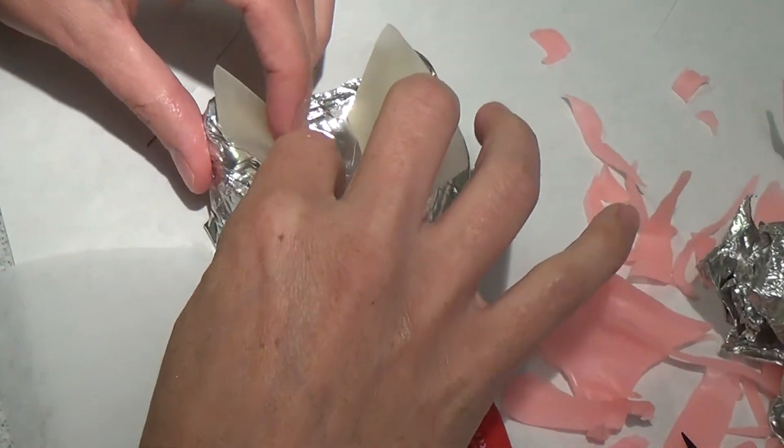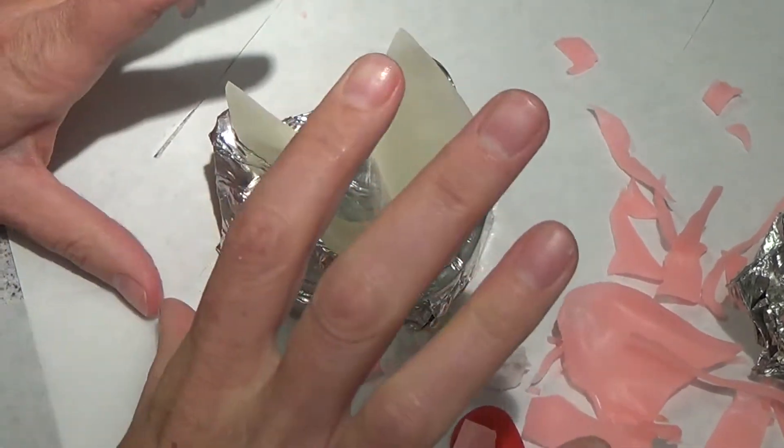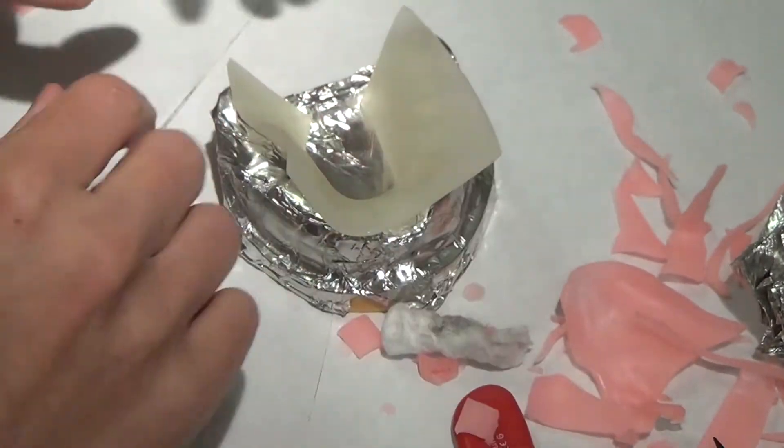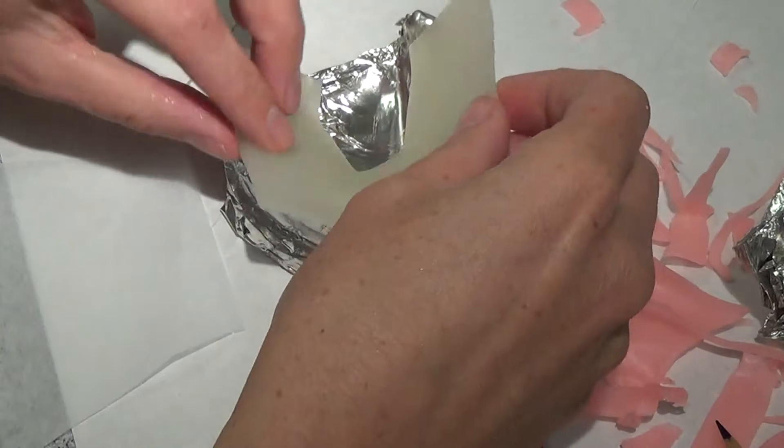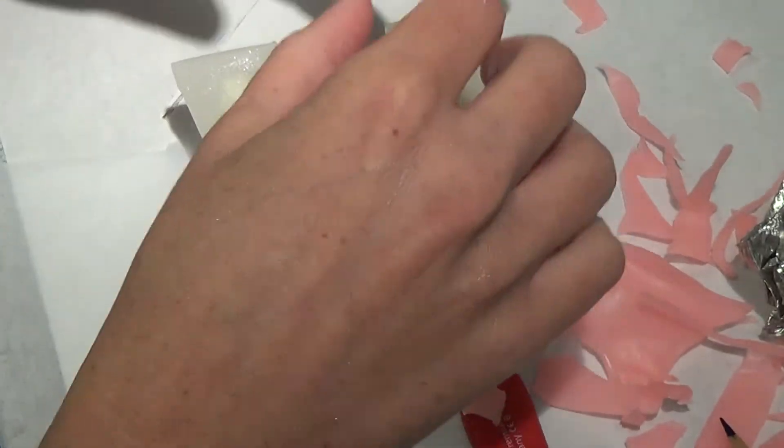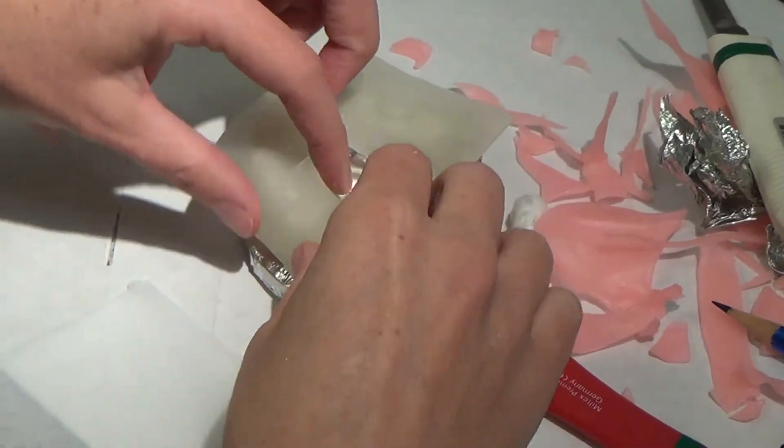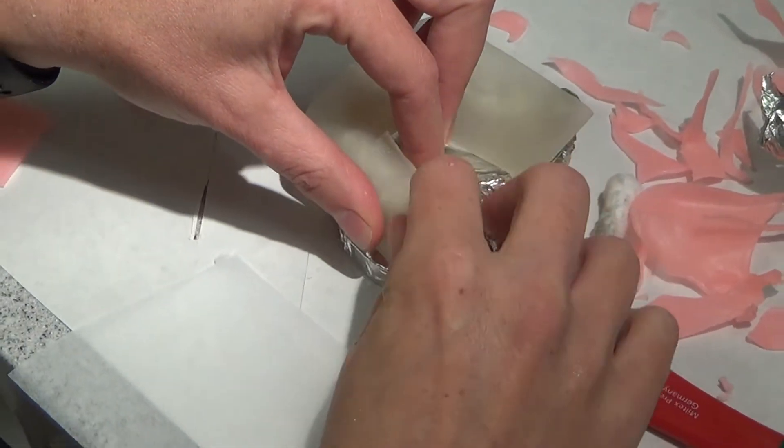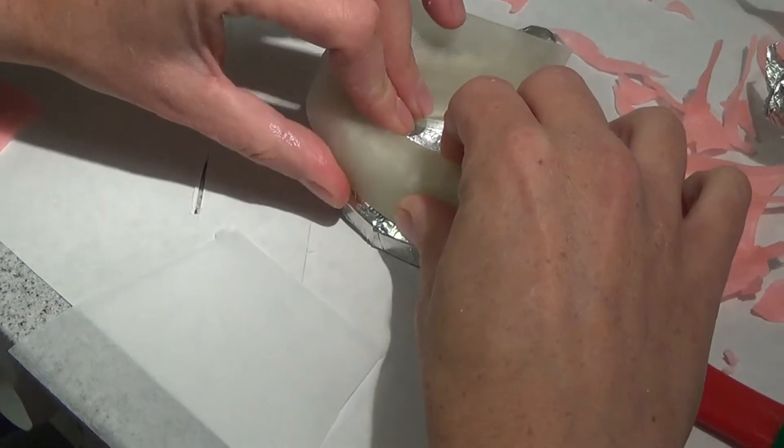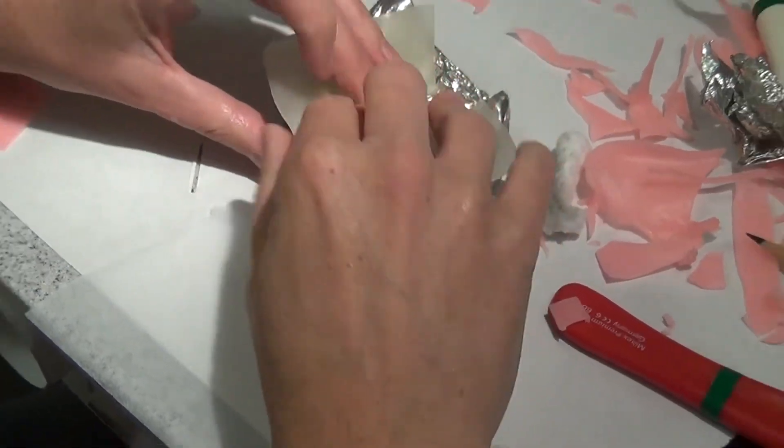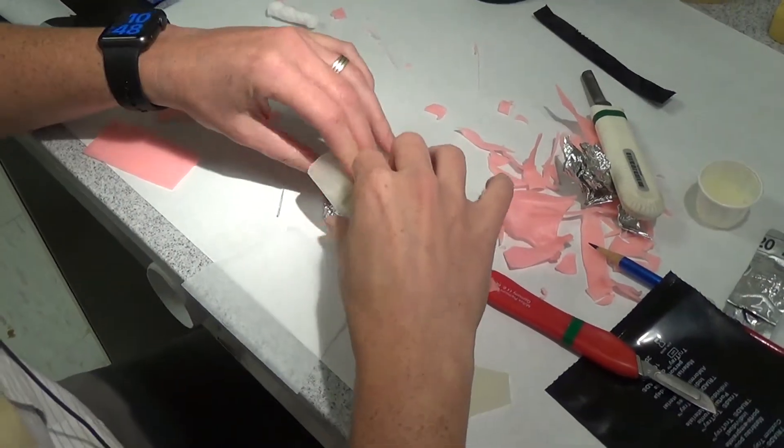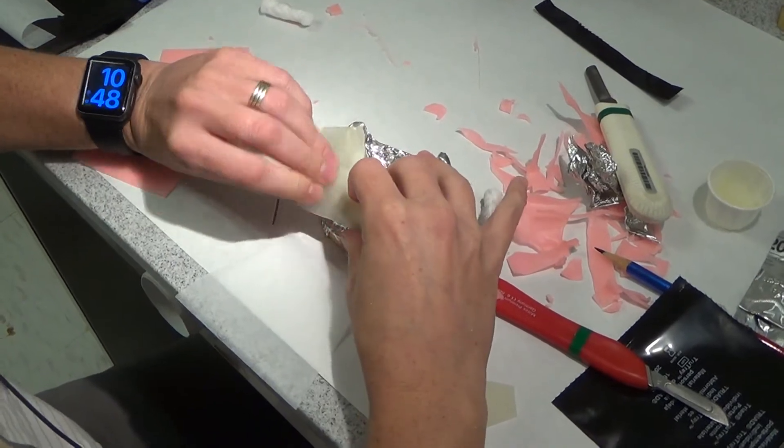What I like to do is do everything either on the front or the back so that I only have to add to one side. If I center this and I push it down, I'm going to be short buccal and lingual. If I start it so that I'm at least full length on one side, then I only have to add to one area. Does that make sense? Just work smarter, not harder.